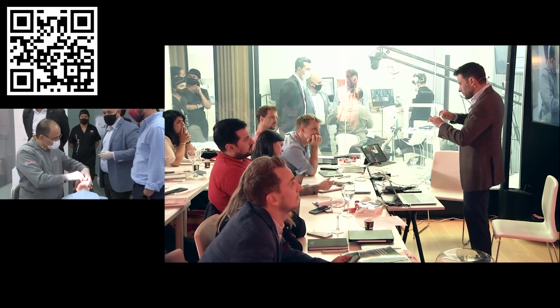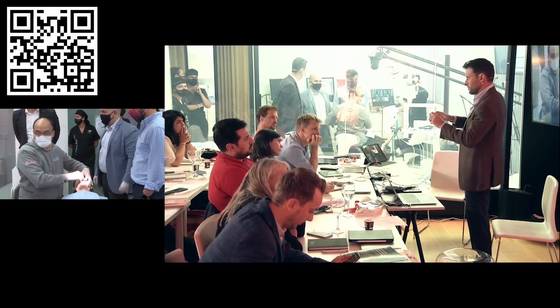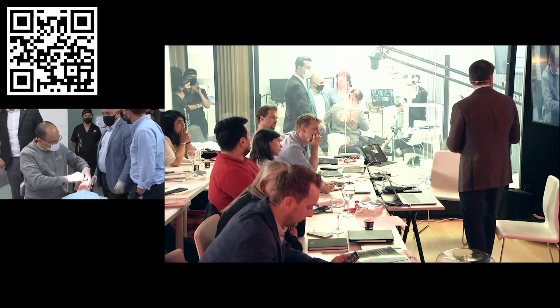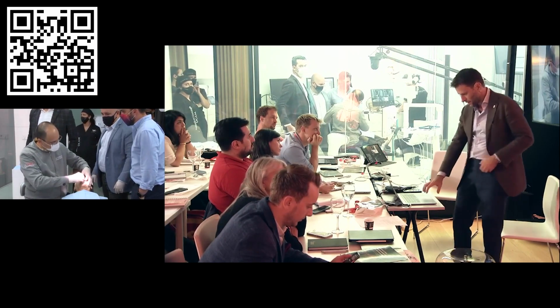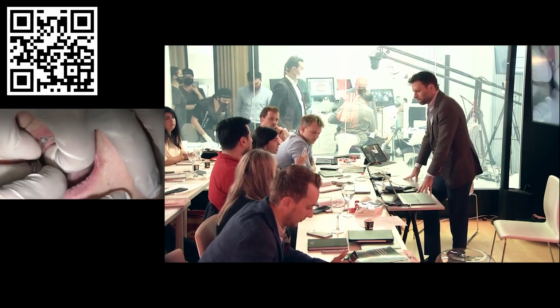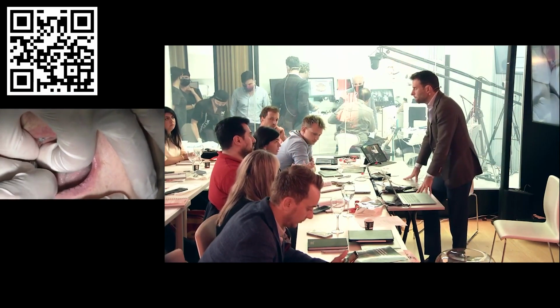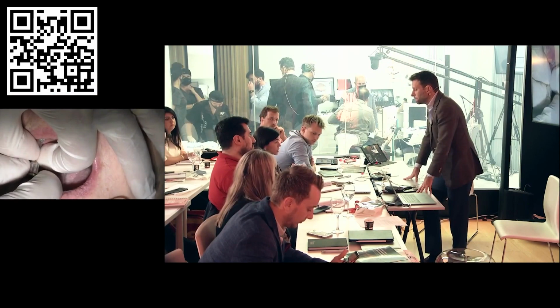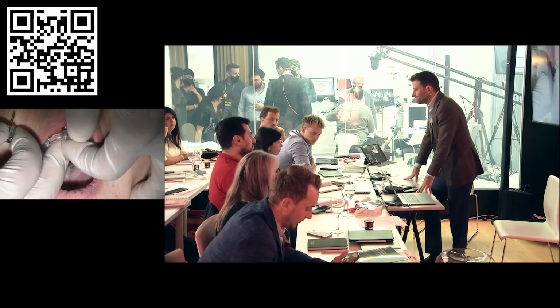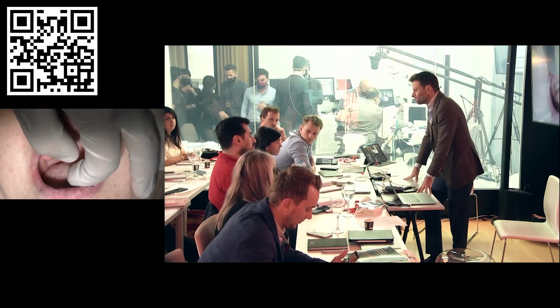Release, cut everything, screw very well, release all the tension, and then connect again. Okay. And there was another question here about, if we cut the bar in between every single implant, to be able to match the scans, we'll have to scan the bar itself and the bar inside the mouth, right?